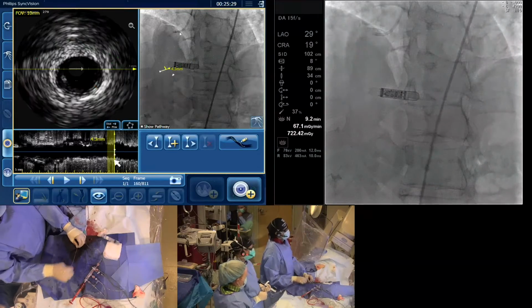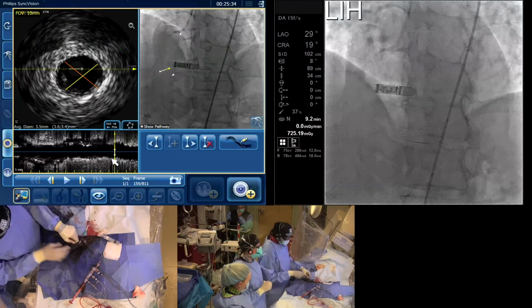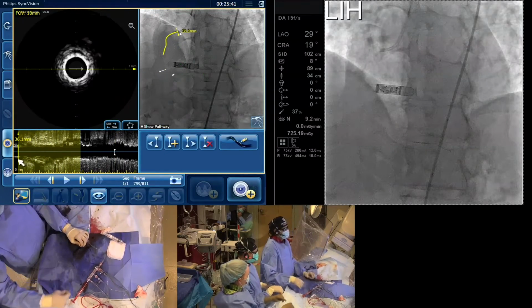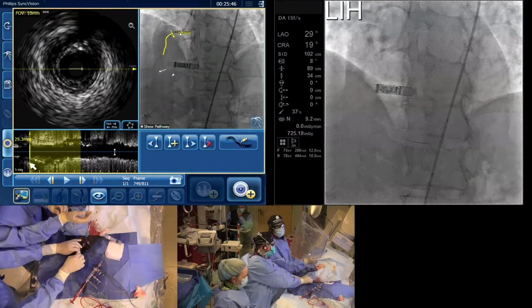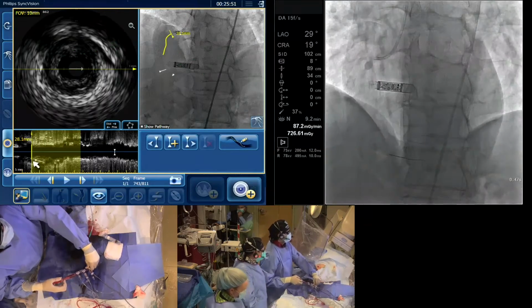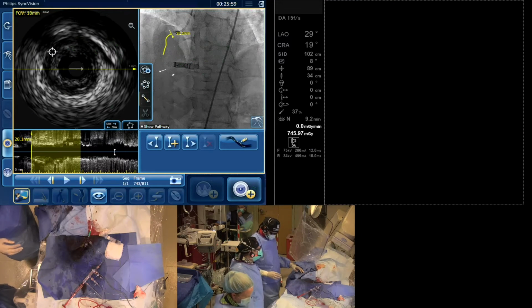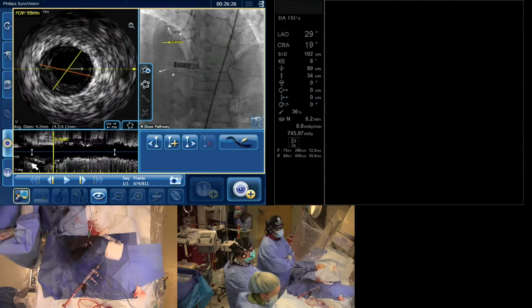23. Okay. Yeah. Can you show us the proximal reference, please, on the IVUS? Somewhere in the proximal vessel so we can see how big it is? You want the NC now, or you want a stent? We'll take the NC at the end, but you can open it. Yeah. Let's just take a tiny little angiogram, make sure we've got our side branch. That's nice. Yeah, so can we have, I would just do a 3.5 by 23. Right, absolutely. Can we have a 3.5 by 23 stent?